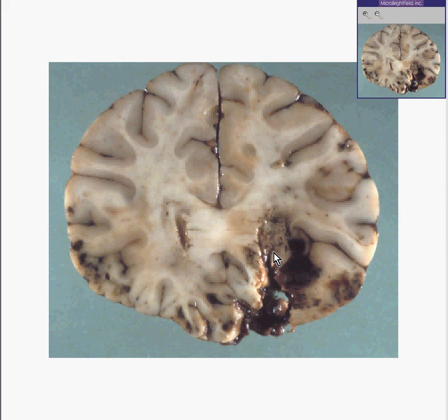We can see that there is hemorrhage. We can see that there is some loss of definition sometimes between gray and white matter. We can imagine that this brain has been contused, like any other part of the body can be contused from simply a blunt trauma.